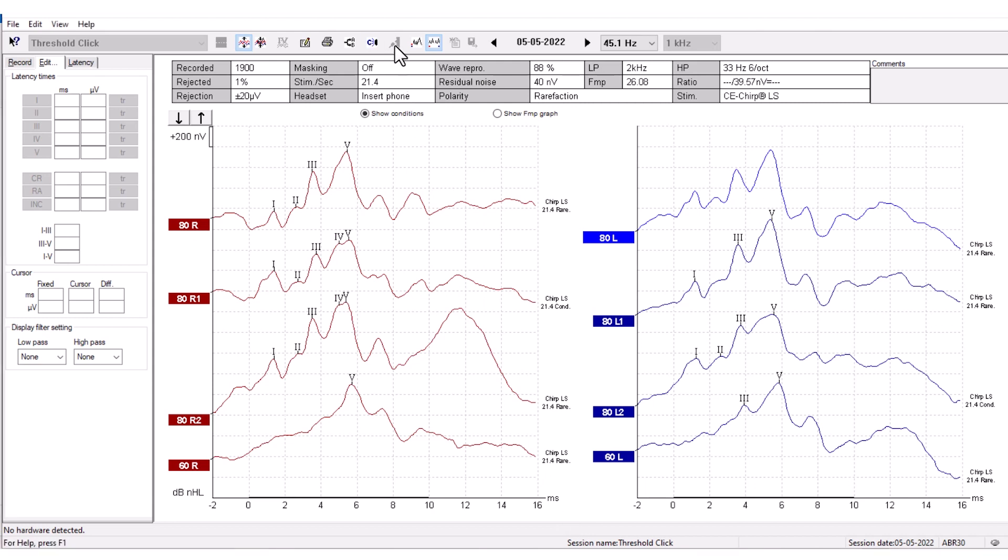This is the Talk Forward function, which allows you to talk to your patient during testing. The test will pause while this function is activated.